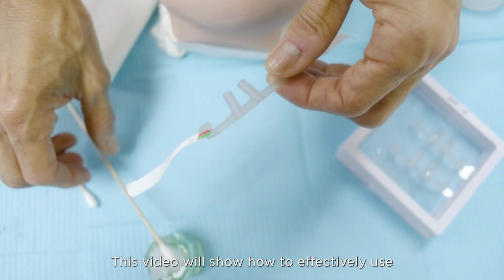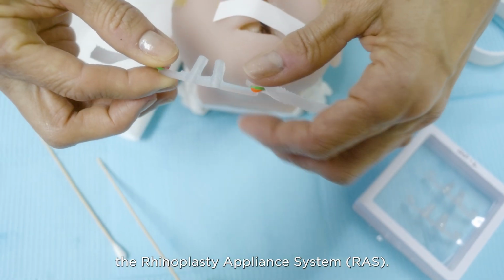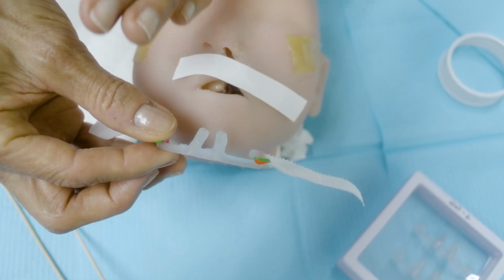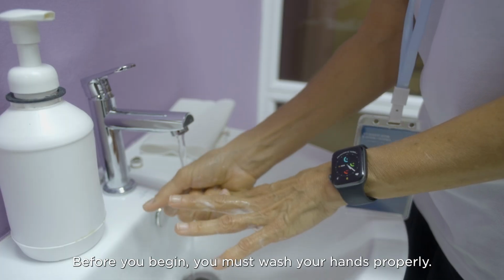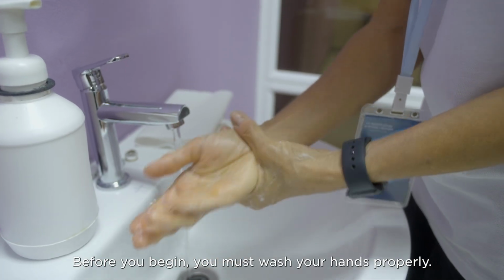This video will show how to effectively use the Rhinoplasty Appliance System, RAS. Before you begin, you must wash your hands properly.